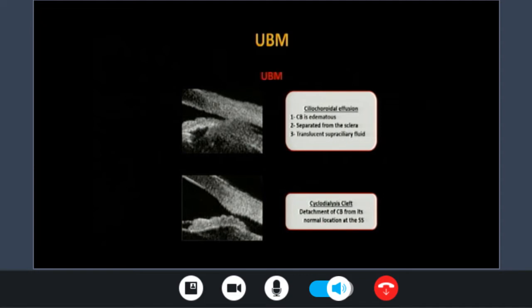And here you can see actually ciliocoroidal effusion. It's important in conditions of what? Ciliocoroidal effusion, aqueous misdirection, to differentiate it from what? Aqueous misdirection. Right? You might have sometimes patients with post-combined or post-trabeculectomy, for example. He's having a pressure of 20, 25, and you are not sure if this is an early stage aqueous misdirection or annular ciliocoroidal effusion. What will happen is that the ciliary body will be edematous, it will be large, and it will be filled with fluids.